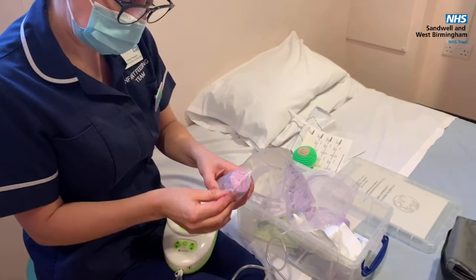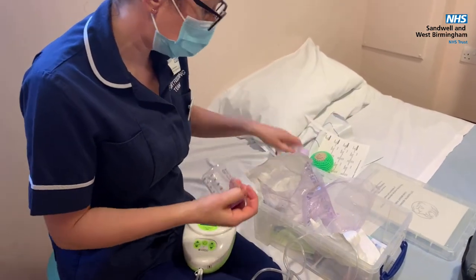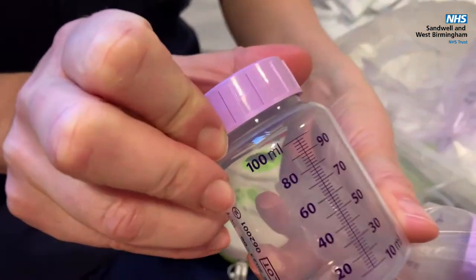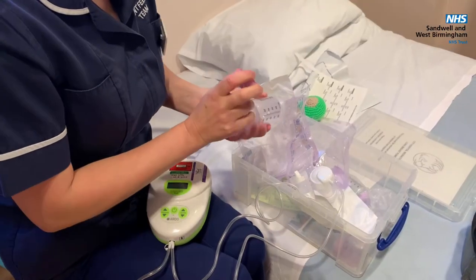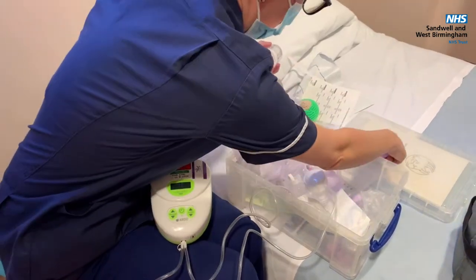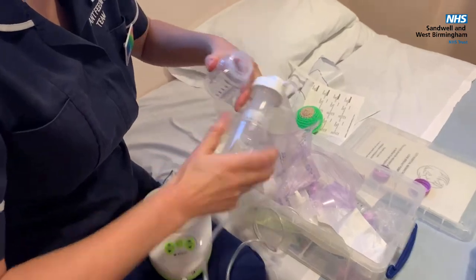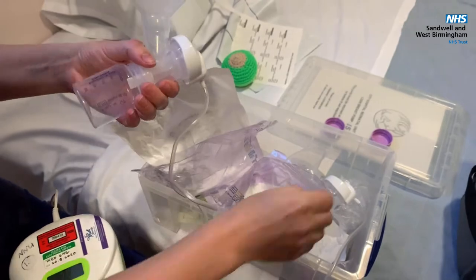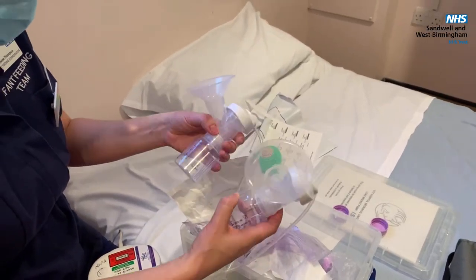We've got bottles in here. Use a new bottle each time you express. That's a 100ml bottle and we've also got the 50ml bottle. Take the lids off and screw the bottles on. All your equipment should be clean and sterilised before you use it, and remember to wash your hands before and after expressing.